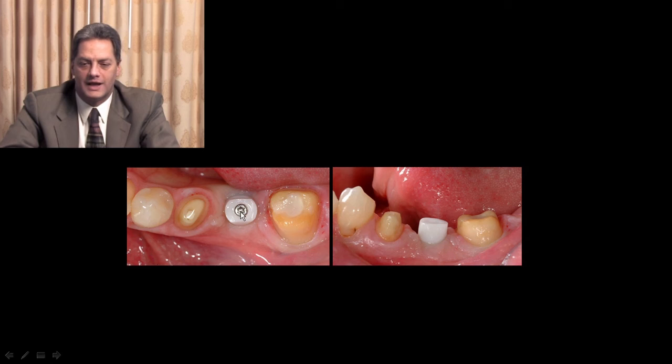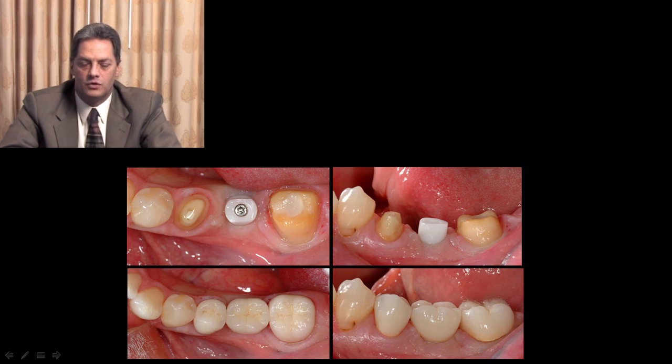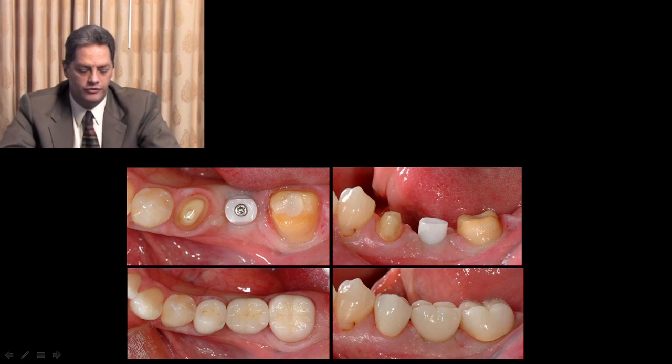We'd like to torque tighten the zirconia abutment. And here we have an occlusal and buccal view of the final restorations permanently cemented. In this particular case, we use Fuji Plus from GC.